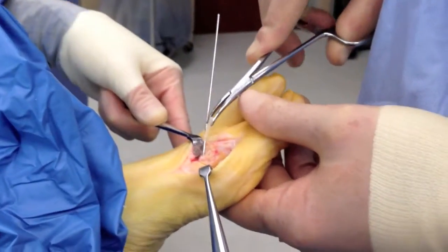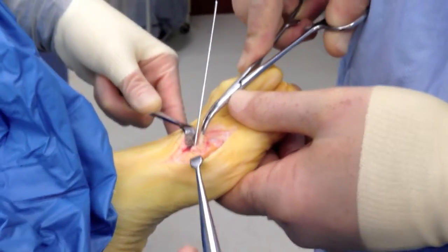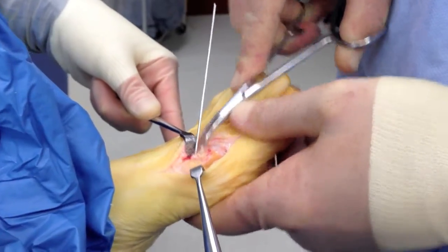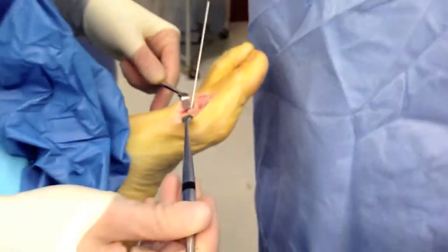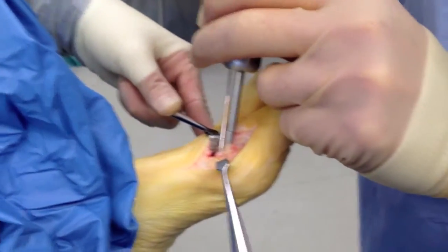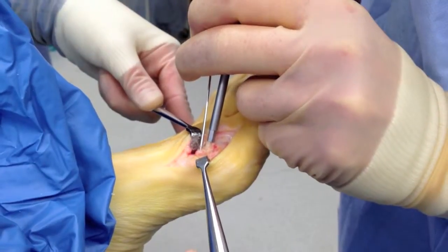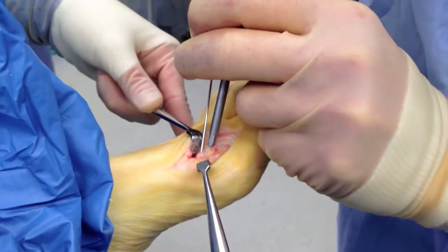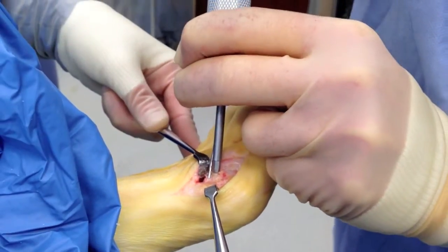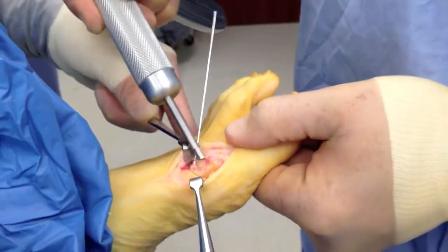Now with the other pin — remember, it's not parallel, it's angled a little bit inwards. We'll slip it down to that area where the fin is until it stops, and then tamp it in the rest of the way. And there you go — it goes in nice and flush.